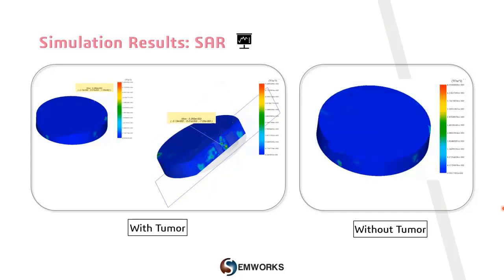There is a difference between SAR maximum values. The difference inside the breast tissues without and with tumor are important to detect the presence of the tumor. So we can identify the breast tumor location based on SAR maximum value. Since breast tumor will be detected due to the dielectric properties that are large difference between normal breast tissue and malignant tissue. So we can check here the coordinates of maximum SAR value, and there the tumor is inserted.